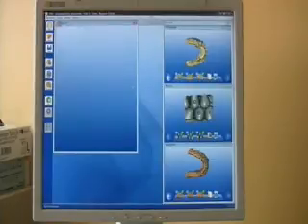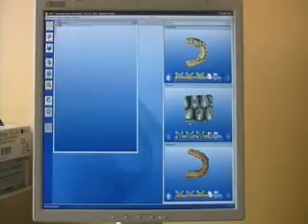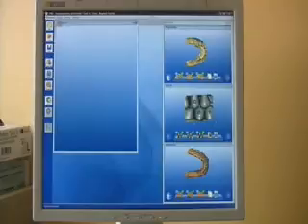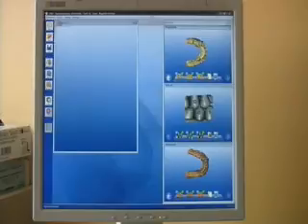Here's the image catalog and you can see that we have the full arches — maxillary and mandibular. We use a product called liquid reference, which you can see, to define dots on the buccal bite images. Liquid reference is an aid to help with destitching in a buccal bite.